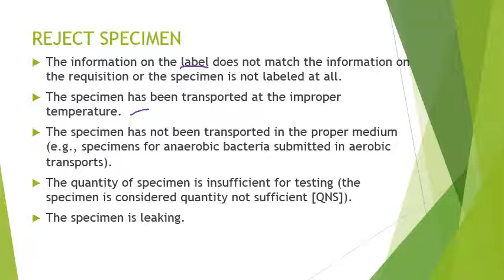The specimen has not been transported in the proper medium. For example, a specimen for anaerobic bacteria submitted in aerobic transport. An example of this is when the doctor's request is anaerobic culture.